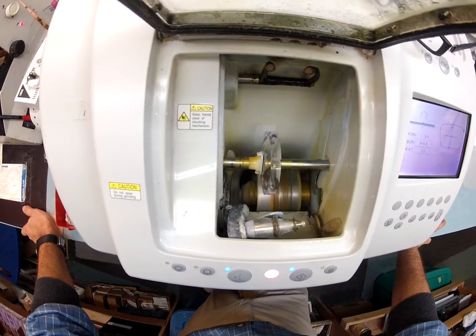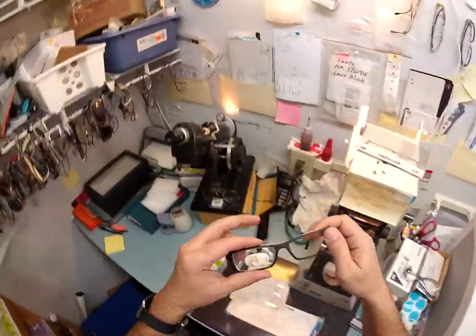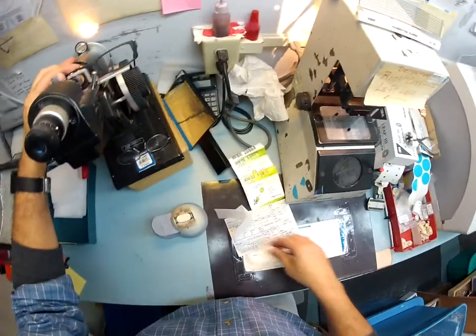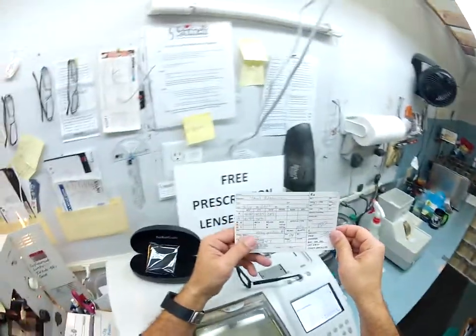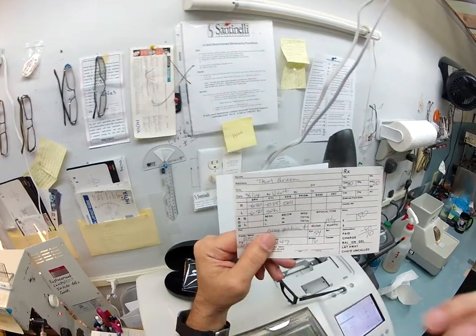And now we are going to start cutting again. While this is doing that, I am going to go ahead and keep working. I am going to take this block off and go ahead and inspect the lens. You are at minus 6.50 minus a quarter at one — minus 6.50 minus a quarter. With your prescription it reads minus 6.50 minus a quarter at one. Your left eye is minus 6.50 sphere.